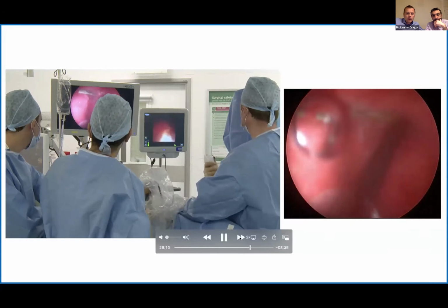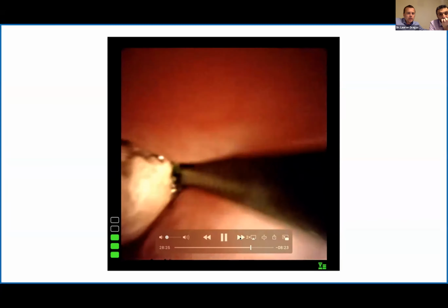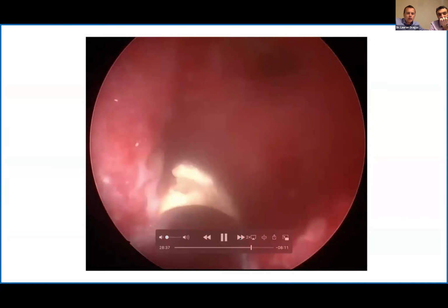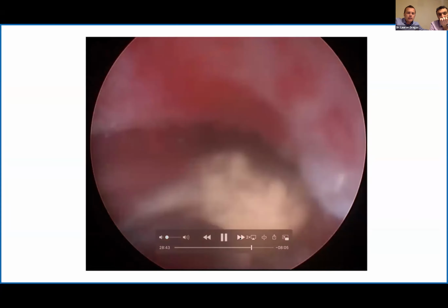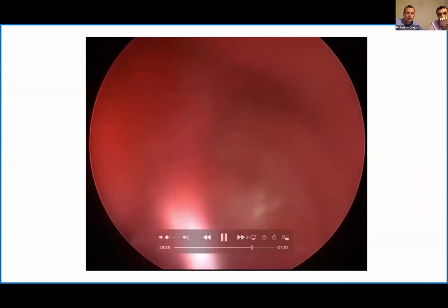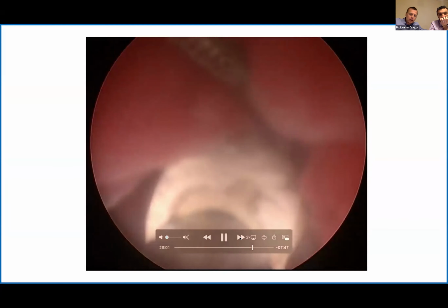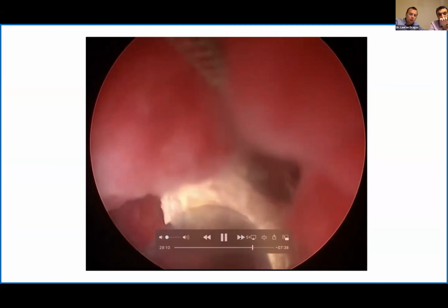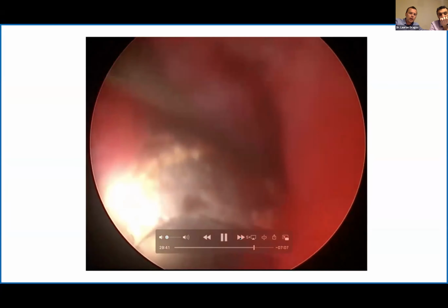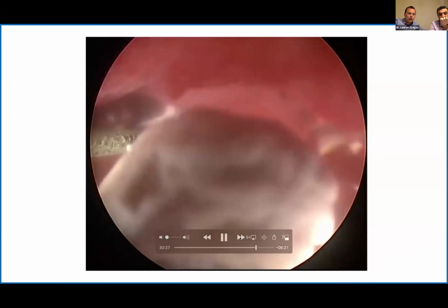Yeah, so just a few more things that I would like to share with you, because it was interesting for us as well. I think this is the one that Kasra told you about. At some point he was breaking the stone, but not very successfully, and there were still some fragments, again going down to the PUJ, though now I'm much braver with my scope. I stay there, I try to provide some support for him. I know we are more or less towards the end of the procedure, and you'll see that Kasra is going to, yeah, that's it.